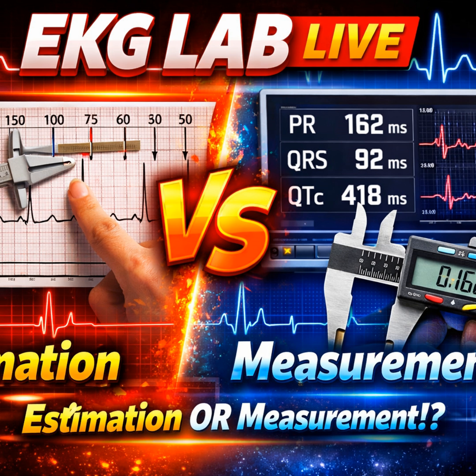Right, so you have your base seconds. Then you count the remaining small boxes for any distance that doesn't fit into a large box, and you multiply those by 0.04. Finally, you add these values together to get the total duration in seconds. You are literally describing a multi-step math equation during a cardiac event. I am describing diagnostics. If you calculate a pause of 2.8 seconds versus 3.2 seconds, that distinction is massive. It can determine whether a patient needs a pacemaker immediately or just observation. You cannot eyeball a 3-second pause with sufficient accuracy to make a surgical decision.